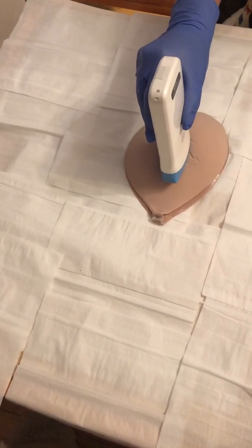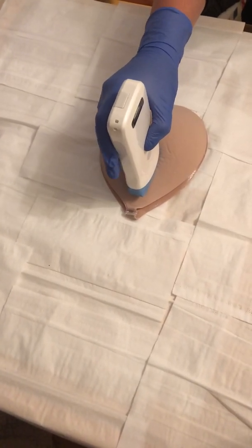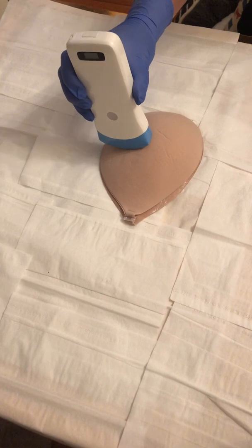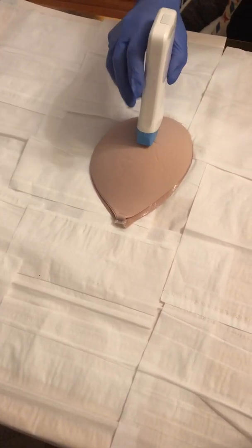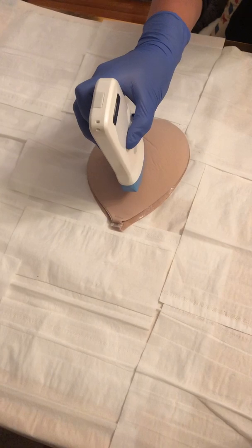So we would then repeat that movement. We would move superiorly with some slight overlap on both of those planes to make sure that we don't miss any lesions or breast anomalies. So again, we're just going to be rotating in a clockwise fashion, making sure that we heel toe and not lose contact with the breast tissue, and all the way back up to 12 o'clock.